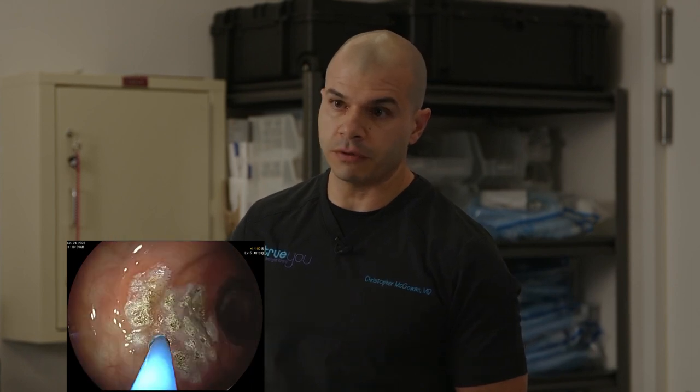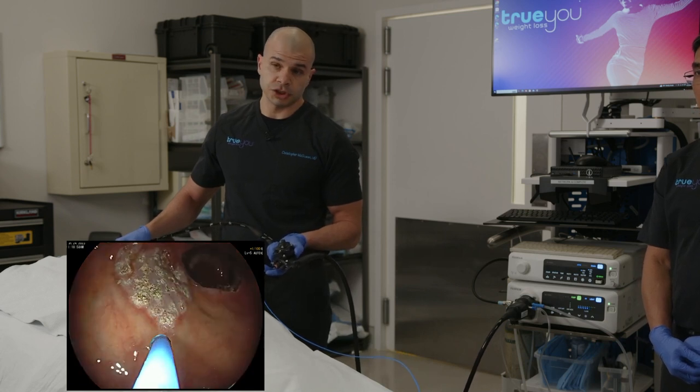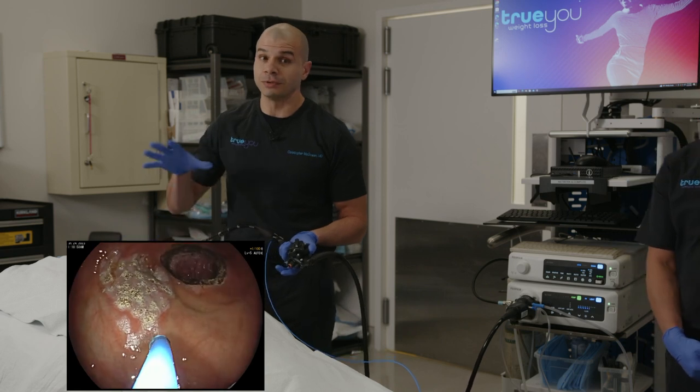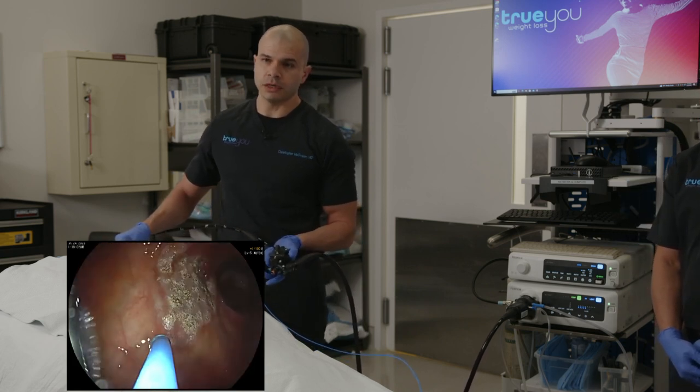She actually had a lap band many years ago, did quite well, but experienced complications from that. There was a band slippage that occurred, and she had that removed, which so often happens with lap bands, which is why they've fallen out of favor. But then she converted to a gastric bypass. Now, she lost from a starting weight of 250 pounds to a lowest weight of 170 pounds. And at her height, that's essentially ideal body weight or normal body weight. So she had an excellent response to her original surgery with 100% excess weight loss, which is quite good.